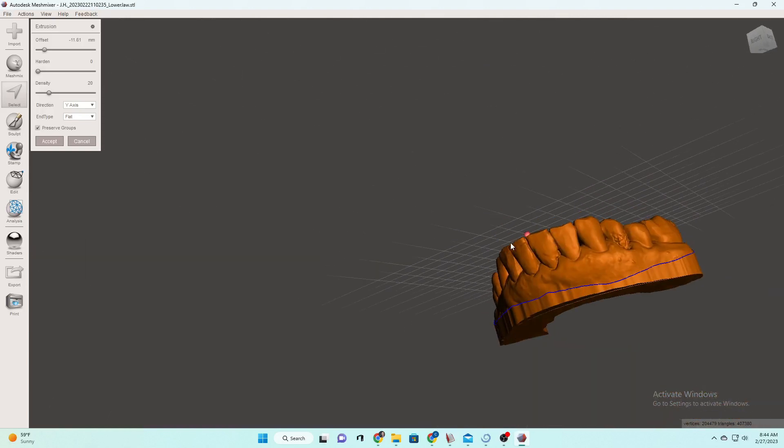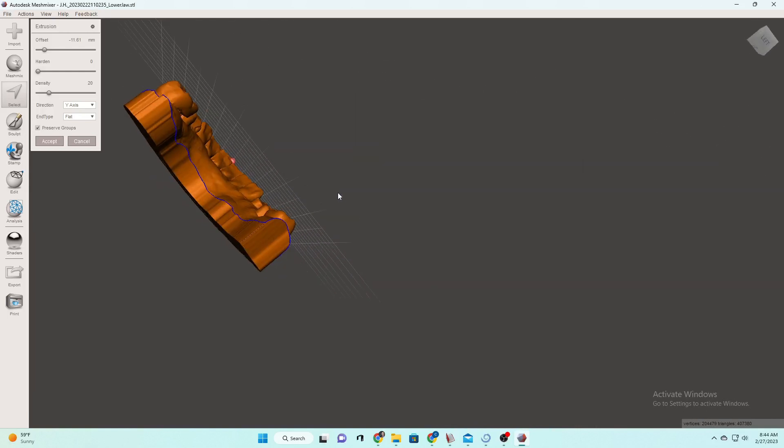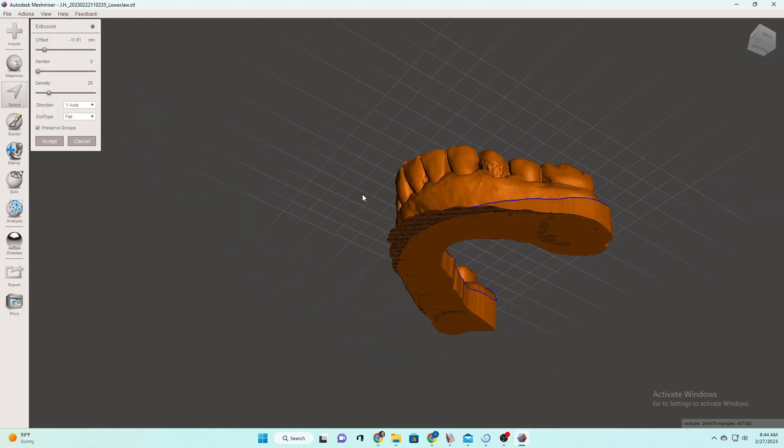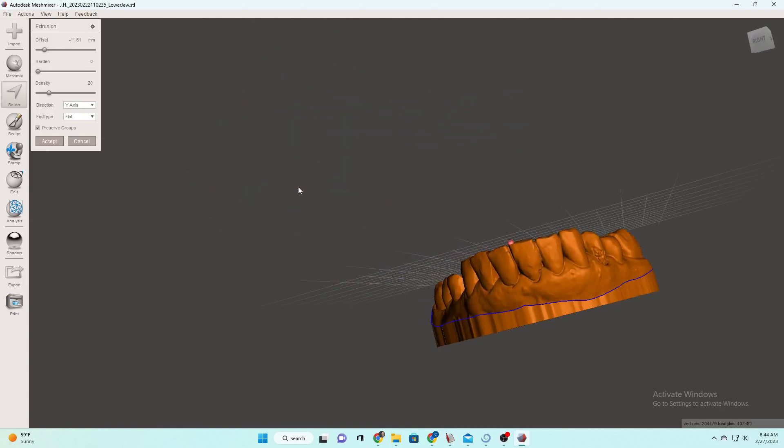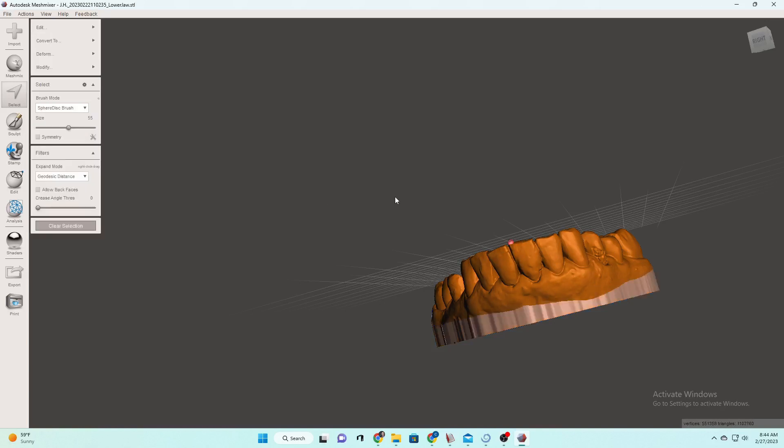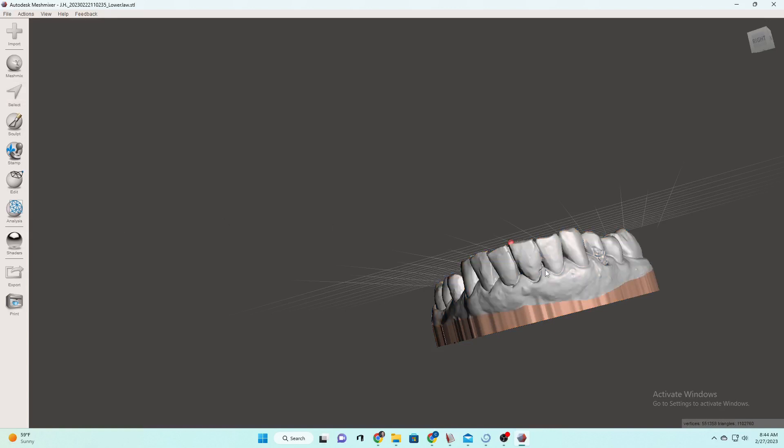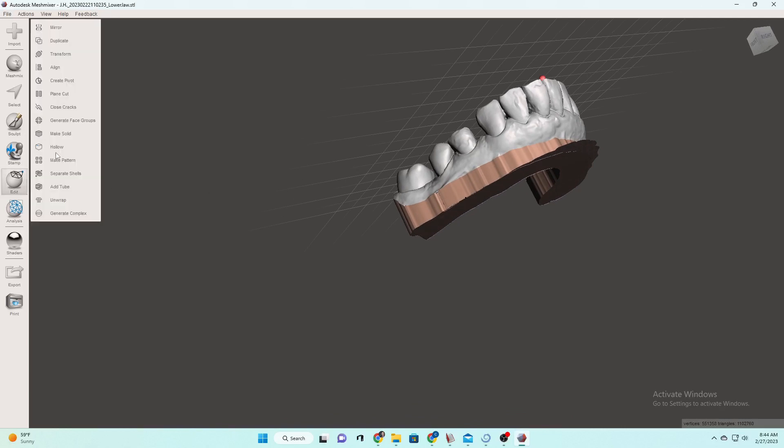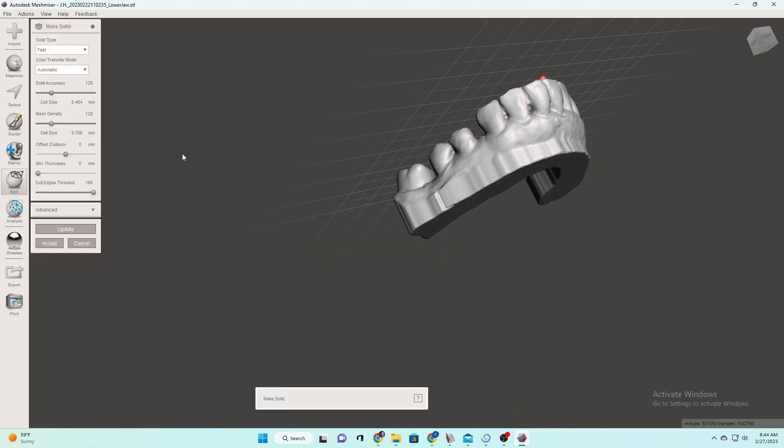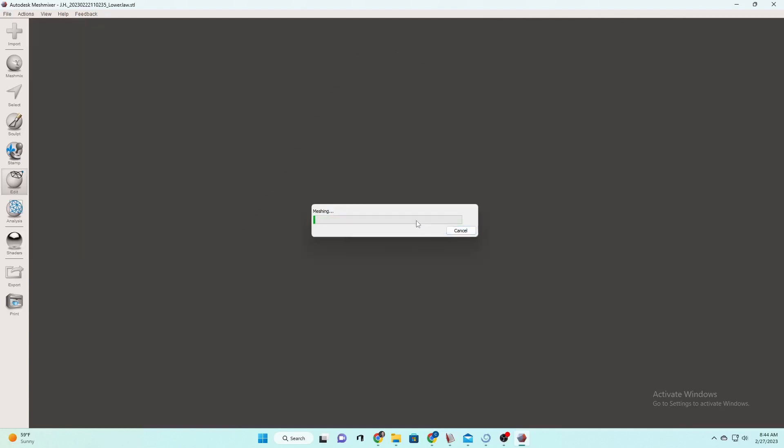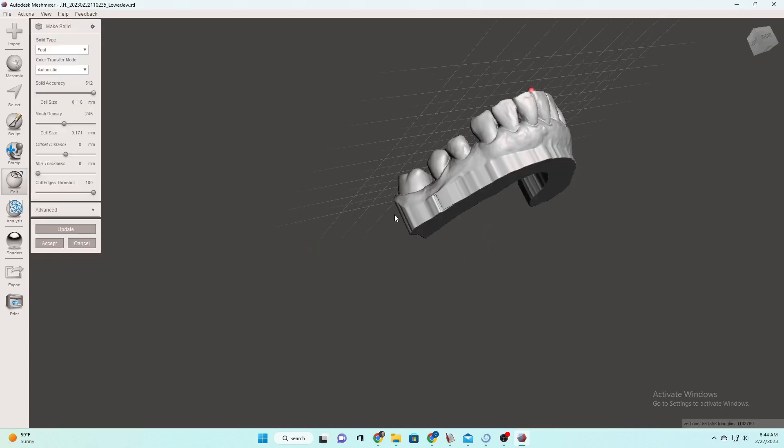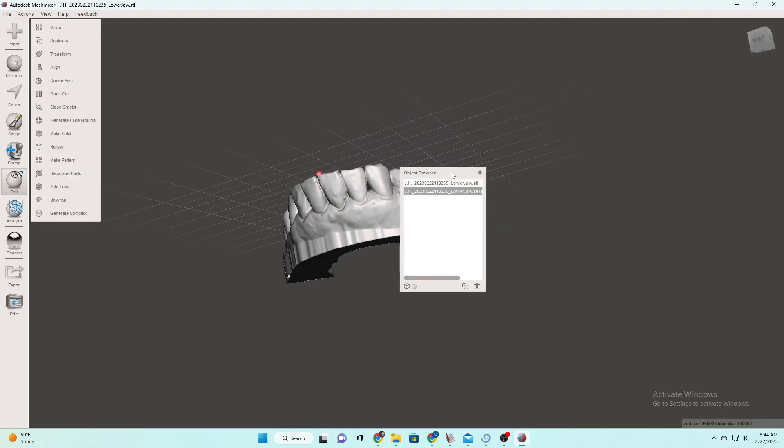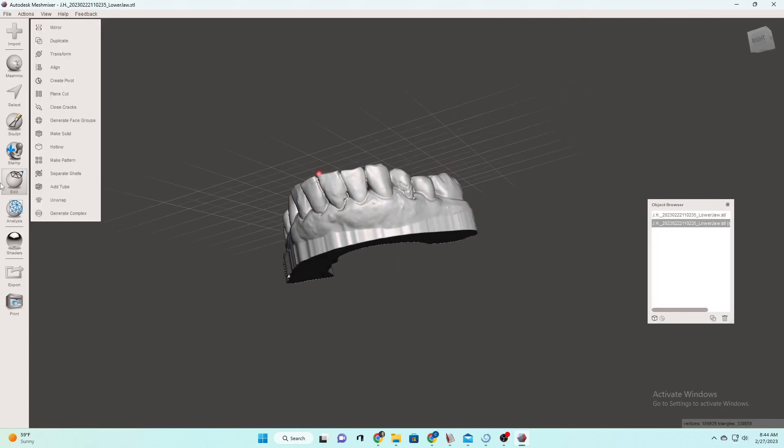This kind of like saying put enough stone, mix up enough stone to pour up a good base for your impression, I guess is my best analogy I could do. So we're past extruded past all those margins so we can accept that. And then we'll make it a solid and do a plain cut to cut off any extra. Beautiful. And you'll notice we didn't have to flip the normals on that one. Only the uppers you have to flip the normals in MeshMixer. But we are going to make that a solid, bring up the solid accuracy and the mesh density, and then update it. You have to update it. And then accept the update.